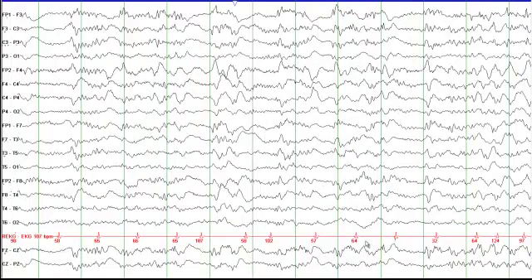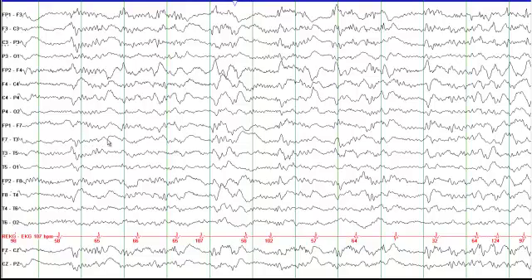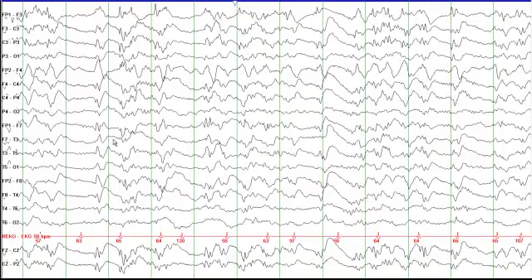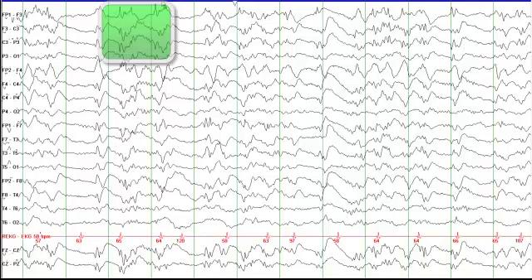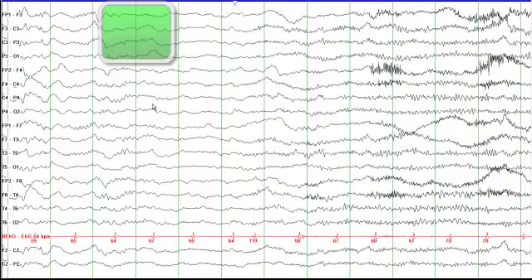We can see a clear evolution. Look at this page and then move on to the next — you can see the amplitude of the slow waves increases as we go along. There are some sharply contoured waves seen in the parasagittal left and right hemispheres. There is no clear lateralization; both hemispheres are involved. As we move on, there is a progression of this slowing with epileptiform sharp wave activity.